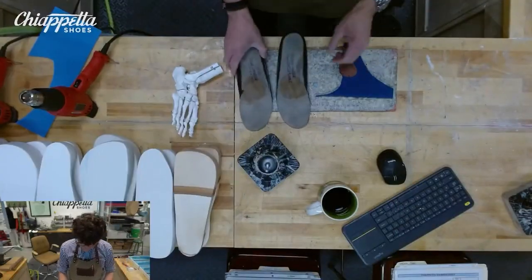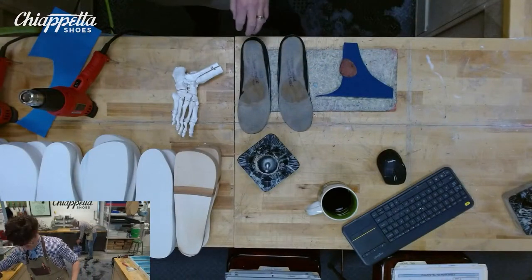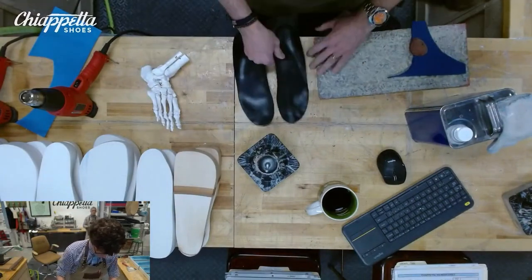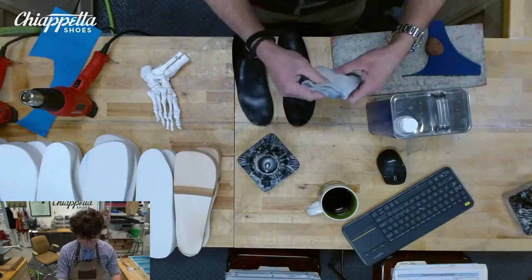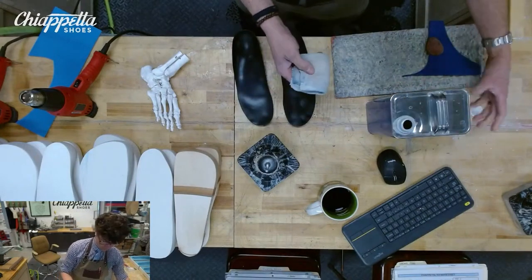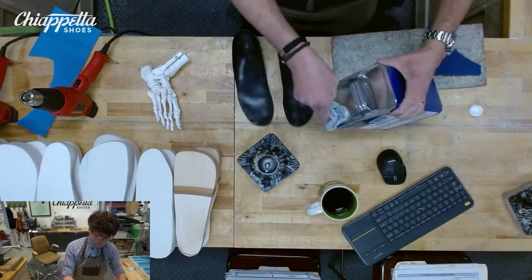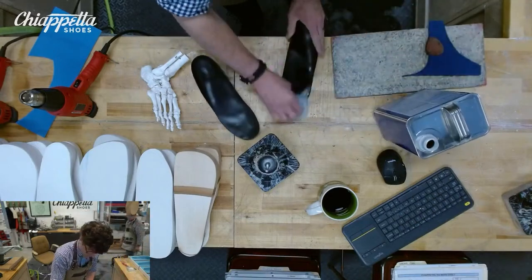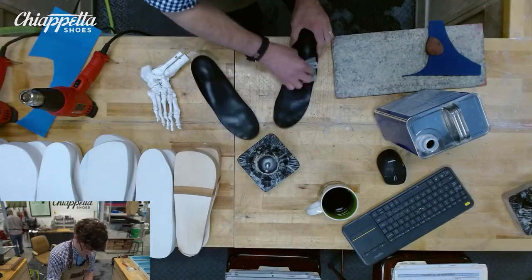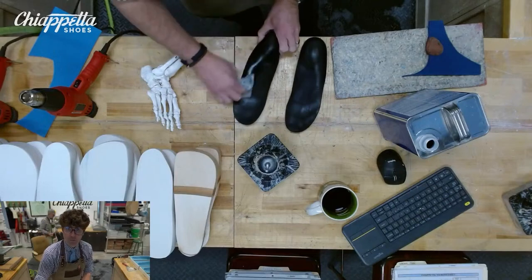So we have a set of orthotics from late 22. We're just going to do a quick refurb on them. The customer wants more orthotics. We're going to use the old mold from 11 of 22 because mechanically there hasn't really been any changes. When we look at the foot, we assign a foot type, quadristep foot typing system, over the course of 7 or less years. If there hasn't been any changes, we'll typically use the old molds.